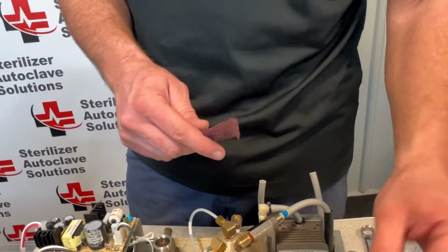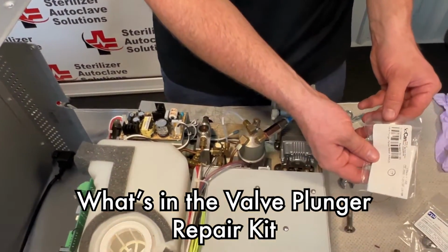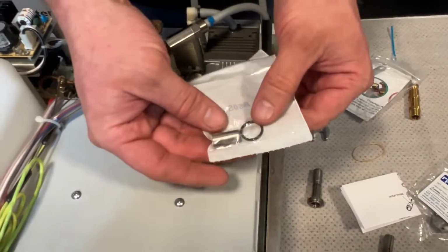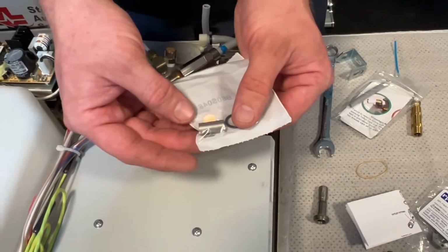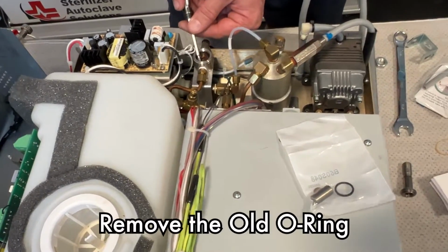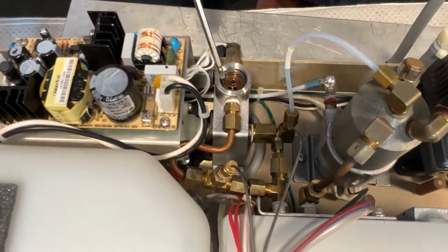If there is a copper spacer in there, you do not need the copper spacer. The valve plunger repair kit comes with a new O-ring, a new plunger, and a new spring, as well as that copper spacer. Like I said, we are not going to put that copper spacer back in. Before we install this, I'm going to remove the old O-ring. And you want to make sure you get all the debris out of there.